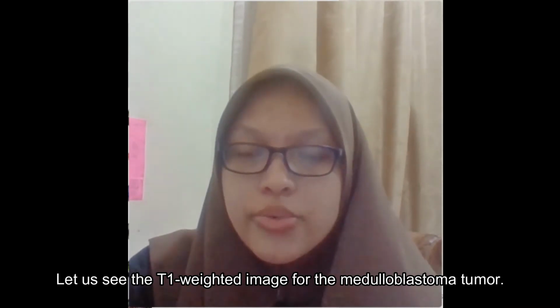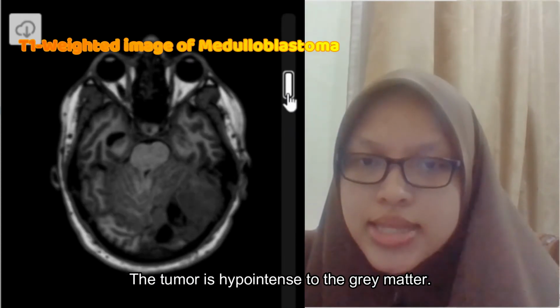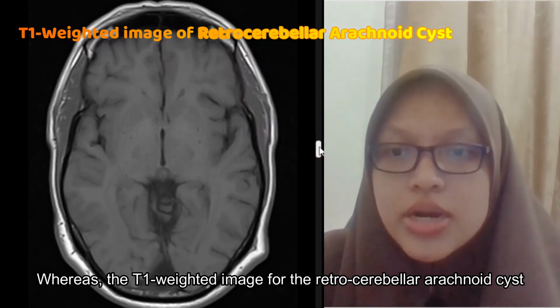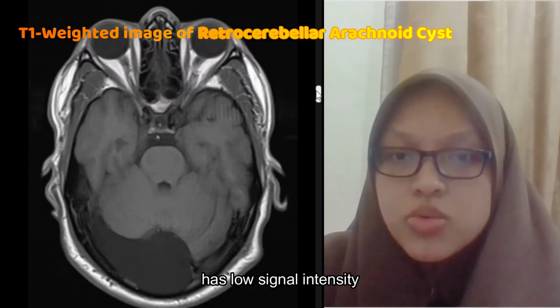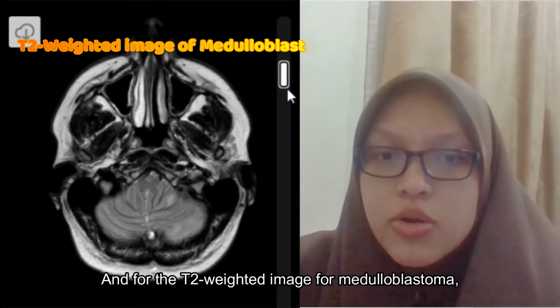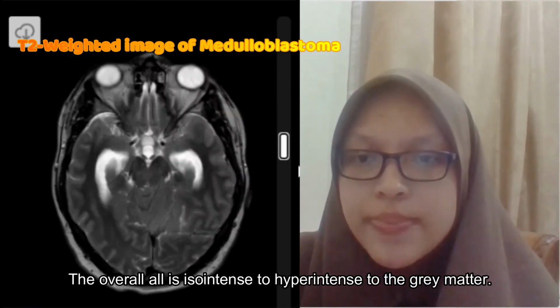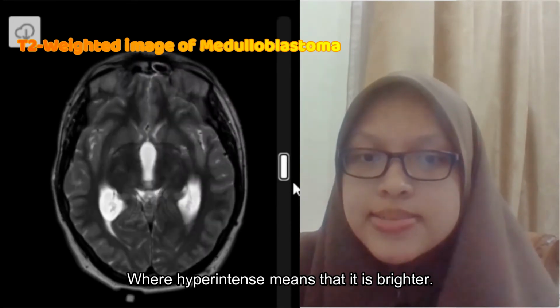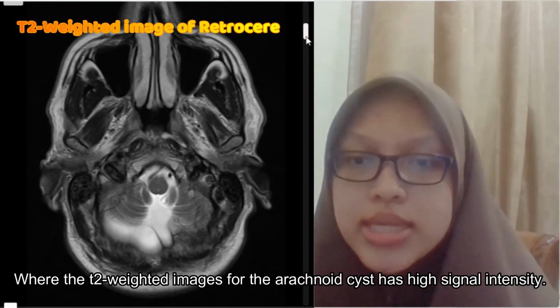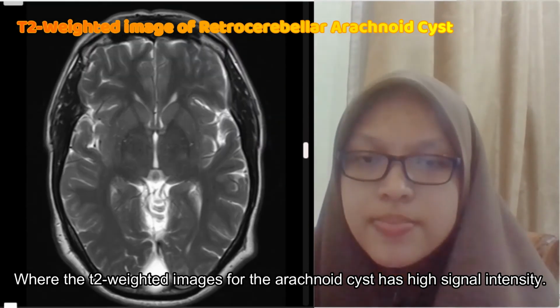Let us see the T1 weighted image for the medulloblastoma tumor. The tumor is hypointense to the gray matter, whereas the T1 weighted image for the retrocerebellar arachnoid cyst has low signal intensity. And for the T2 weighted image for the medulloblastoma, the overall is isointense to hyperintense to the gray matter, where hyperintense means that it is brighter. The T2 weighted image for the arachnoid cyst has high signal intensity.